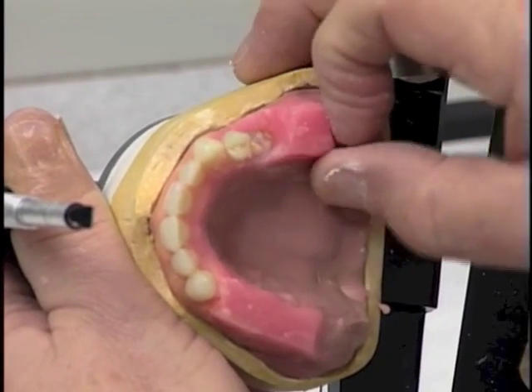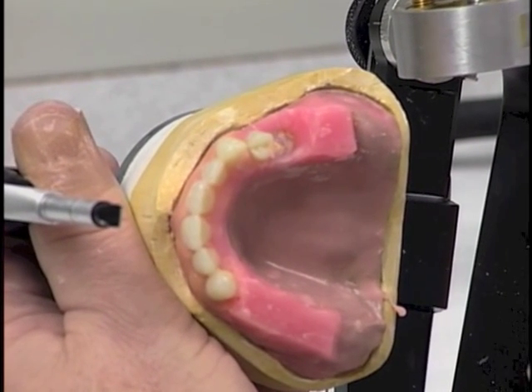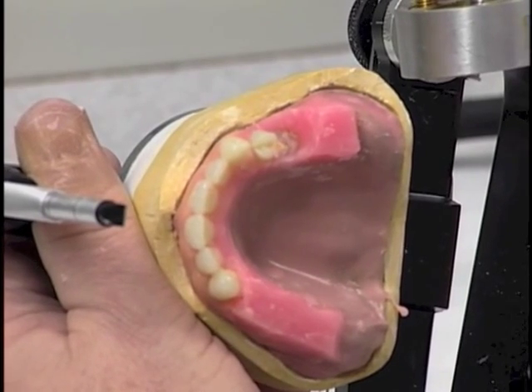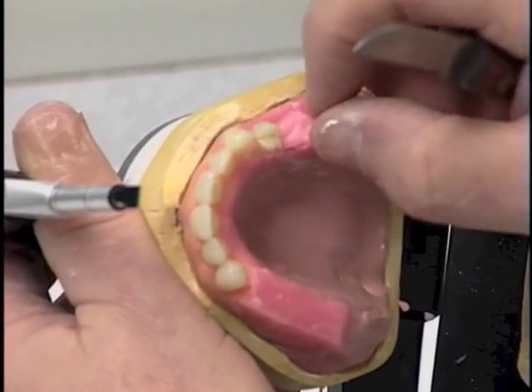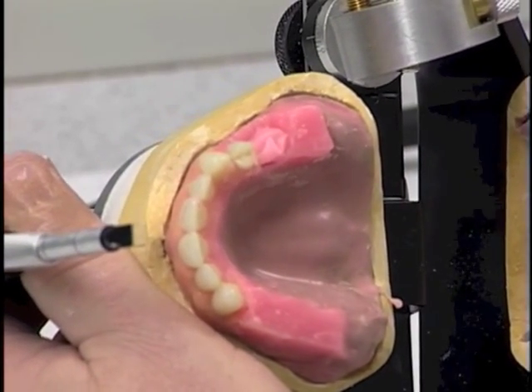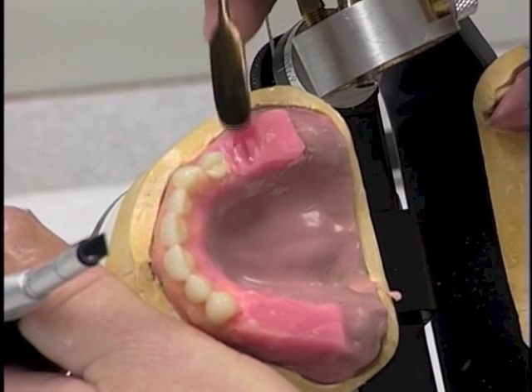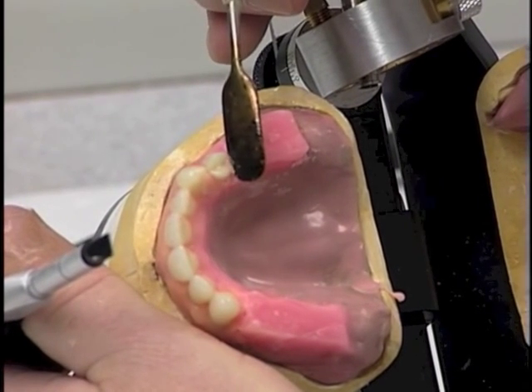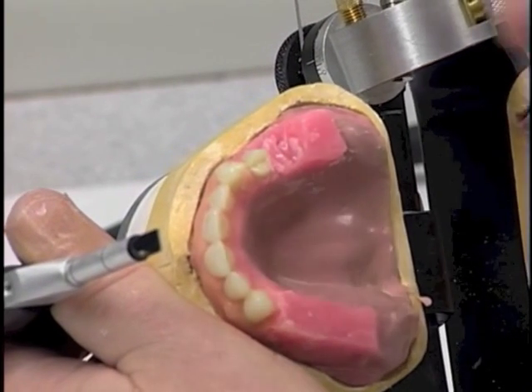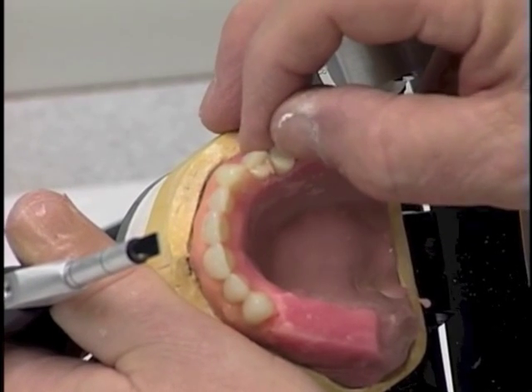Now that we've removed base plate all the way to the cast in that area, we can add a little wax back in. And so what we're going to do is just get a little piece of wax, put some wax back into that area. Now we'll pool the wax. Now this should give us enough room to be able to manipulate that tooth, get it far enough to the lingual, as far as we'd like it to form the proper arch form. Get the lingual cusp hanging a little lower than the buccal cusp.